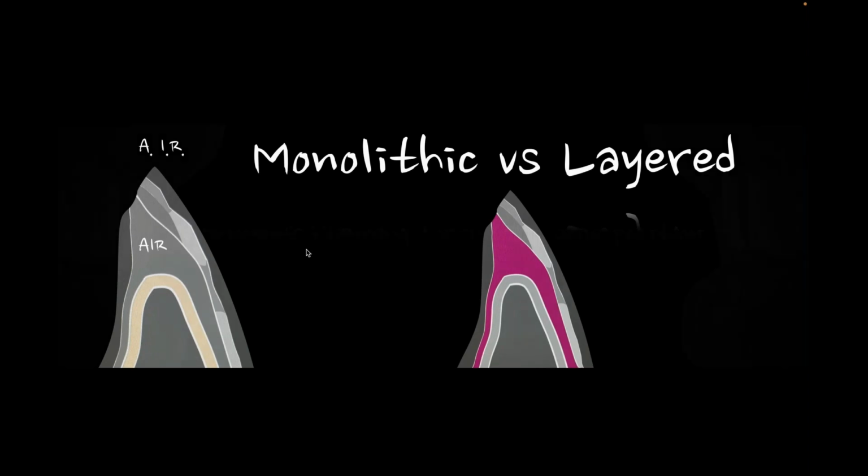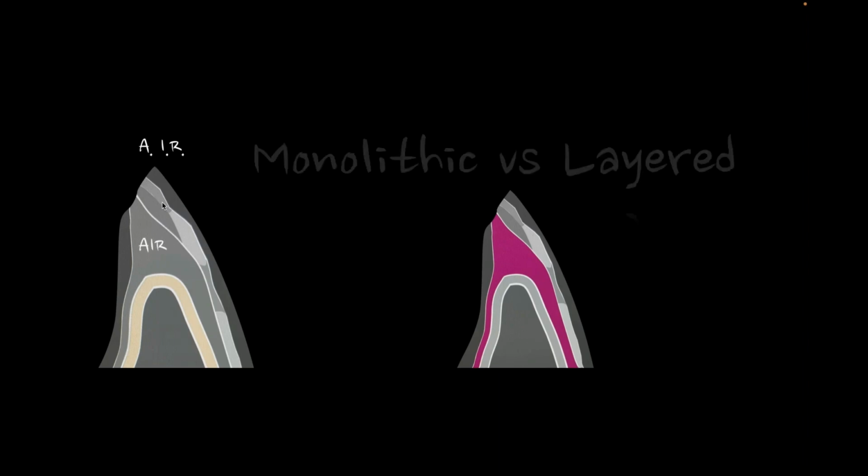Point of it is, though, when I'm working in those monolithic materials, I need to have a material that's going to give me more translucency. So those are coming. And I'm going to need a stain that has a little bit more effect so I can use that to give me more depth and not hide from the amount of translucency that I'm trying to create. So in the monolithic world, I think we'll probably be doing some webinars on that, and I'll be showing some of that more in Chicago.